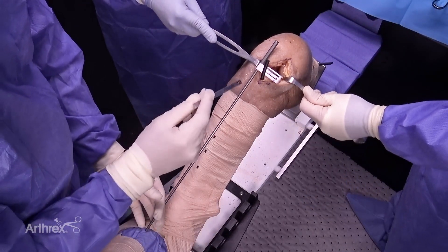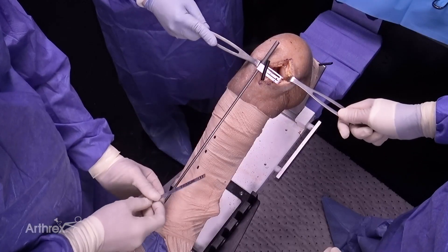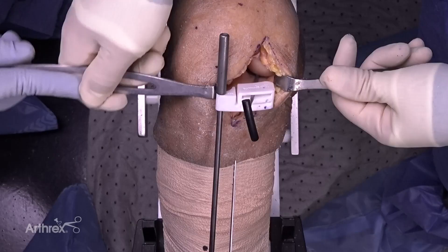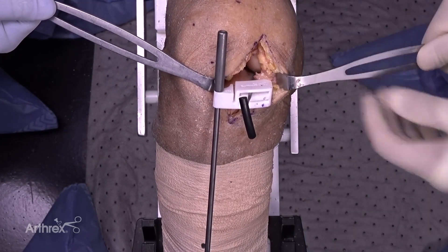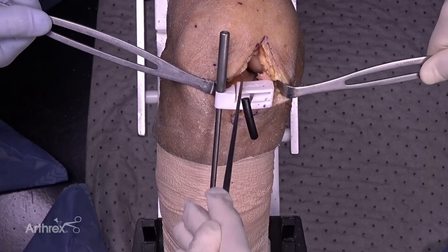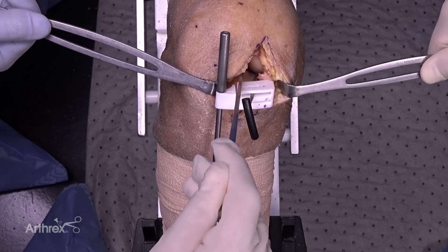I use this ruler that's in the set — there's also an angel wing that can work as well. I'm going to put this in the vertical cutting slot, and from that determine my rotation and position. I utilize the lateral aspect of the medial femoral condyle as my aiming point. It's a patient-specific cutting guide, so to speak.